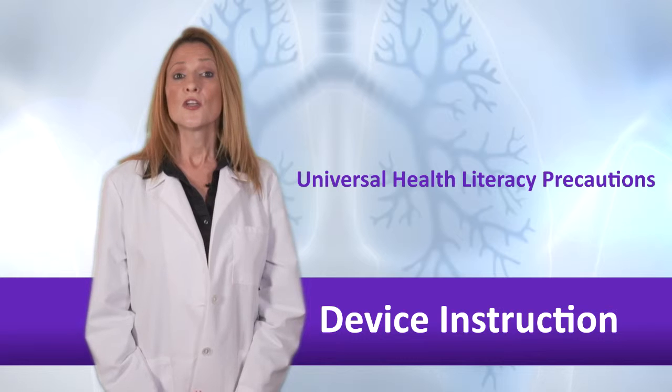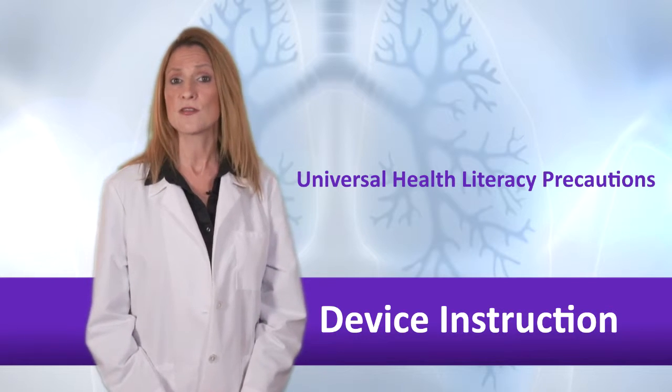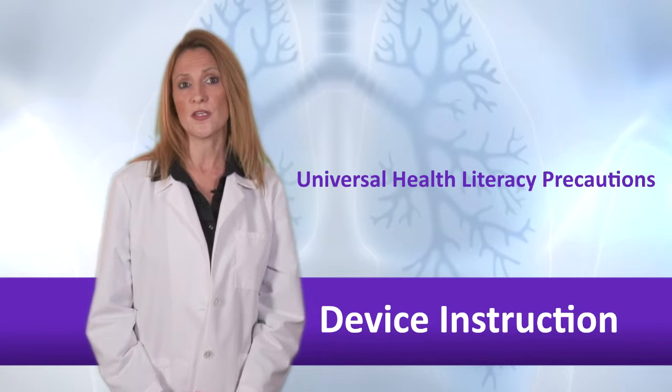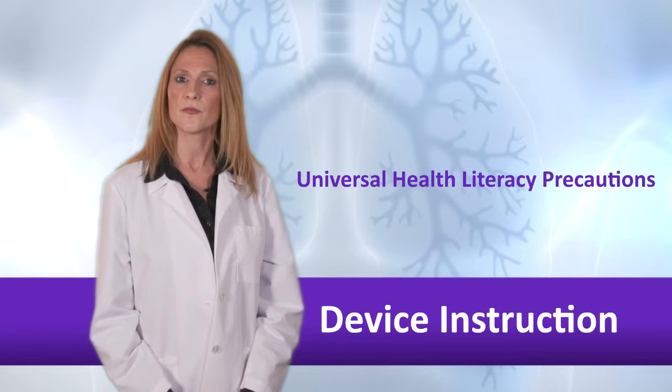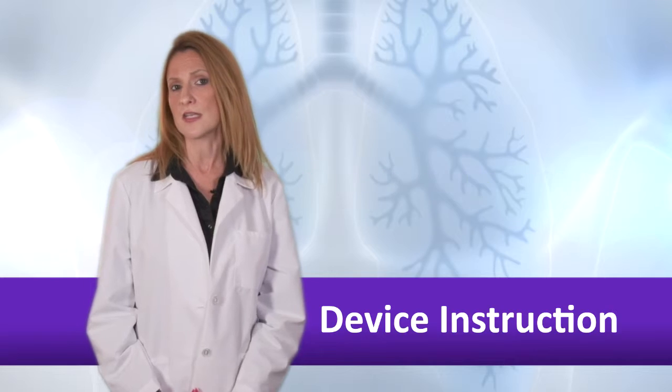For example, show them the device and say, I didn't see in your record that you have used this medicine or a Discus device before. I wanted to be sure that you have all the information you need. What do you know about this so far? Once you have an idea of what the patient knows, you can further tailor the session from there.